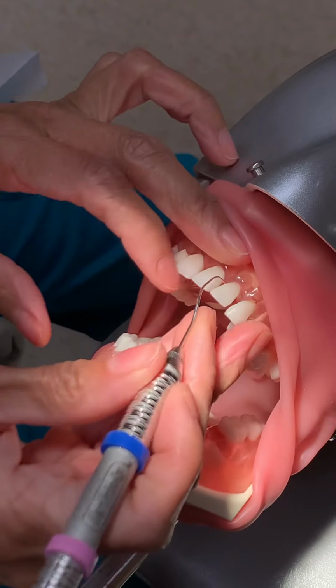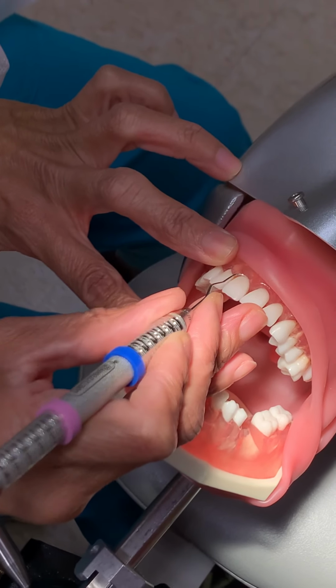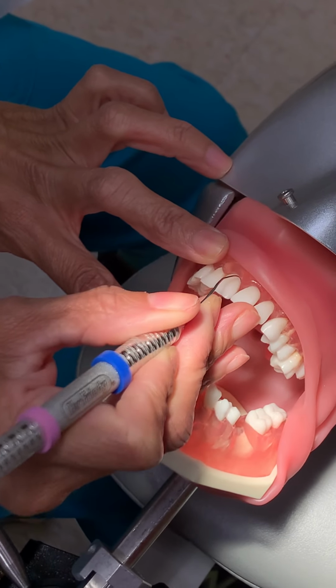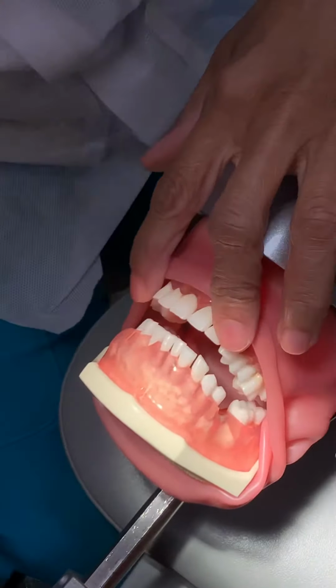So you see how it's pointing towards the tooth? Okay, so my working end, and you remember Cindy talked about the get ready zone. So I'm just going to start at these anterior teeth here to give you the get ready zone. My palm is up, and I'm fulcruming on the incisal edge. Get ready zone. I'm going to slide up in a proximal to the gum line. And I'm going to go in a proximal. So now I'm going surfaces away. So let's go ahead and do the clock position. So I'm 11 to 1.